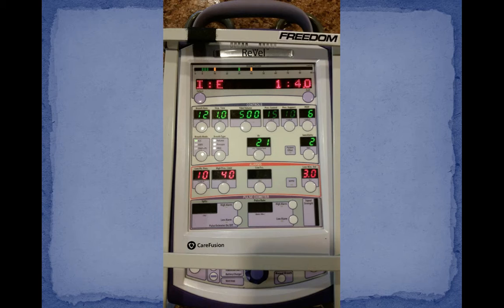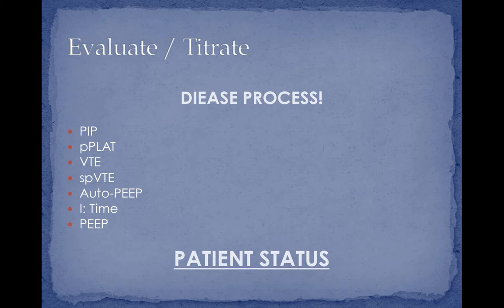Going up to 40 or 50% is a good place to start for patients that are, say, mildly hypoxic or doing all right. You might want to go up to 60, 70% pretty quick for someone who's pretty hypoxic. And when in doubt, for profound hypoxia, just go all the way up to 100% to rule that out. And you'll adjust other things. And we talk about troubleshooting hypoxia in a different podcast as well.